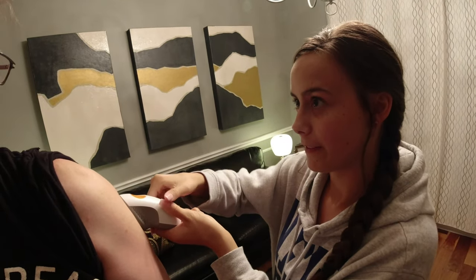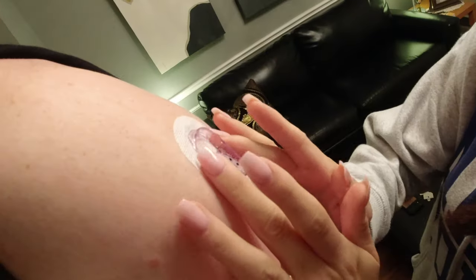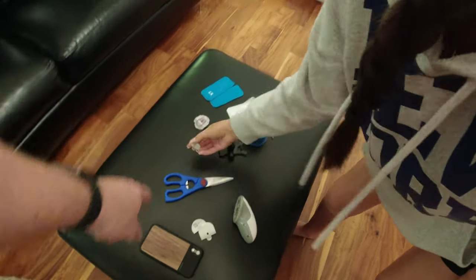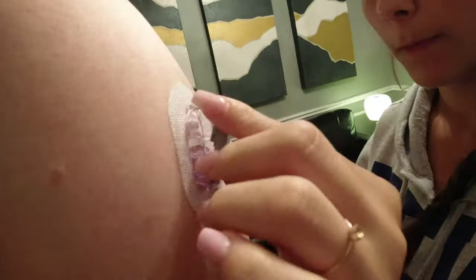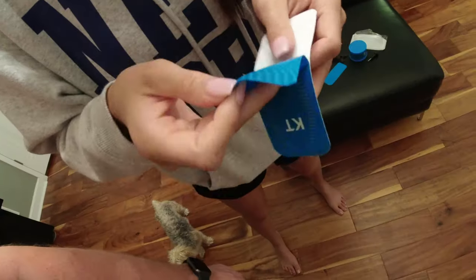Three, two, one. Now pull up. There you go. You can push really hard — you're not going to hurt me. Can't hurt dad. That only fits on one way, then push it in. You hear a click. Click twice — two clicks is the most important thing.